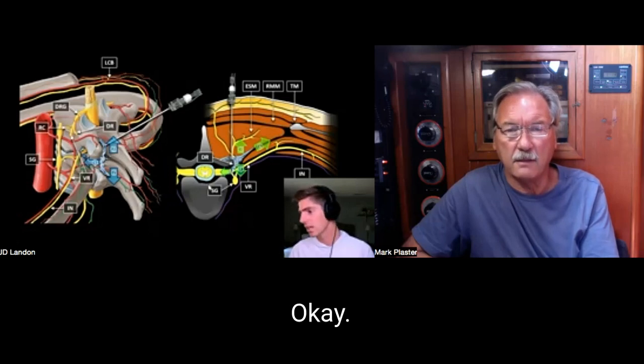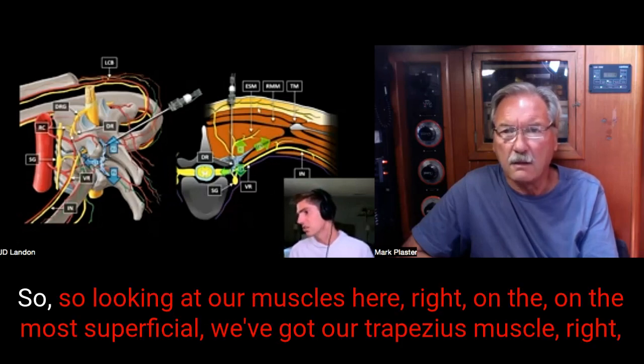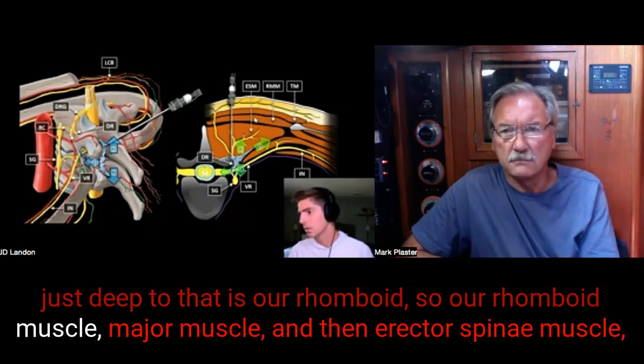Okay. Here's a cut, right? So like an axial view here. So looking at our muscles here, right? On the most superficial, we've got our trapezius muscle, right? Just deep to that is our rhomboid major muscle, and then erector spinae muscle, right?